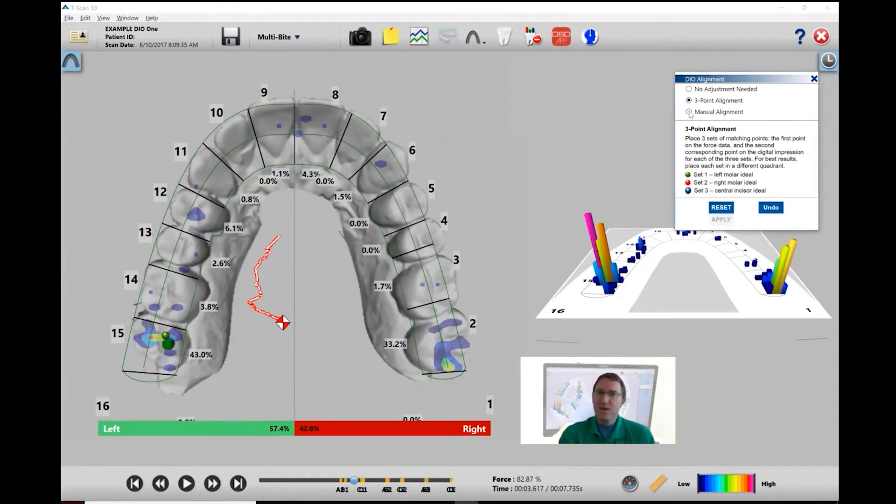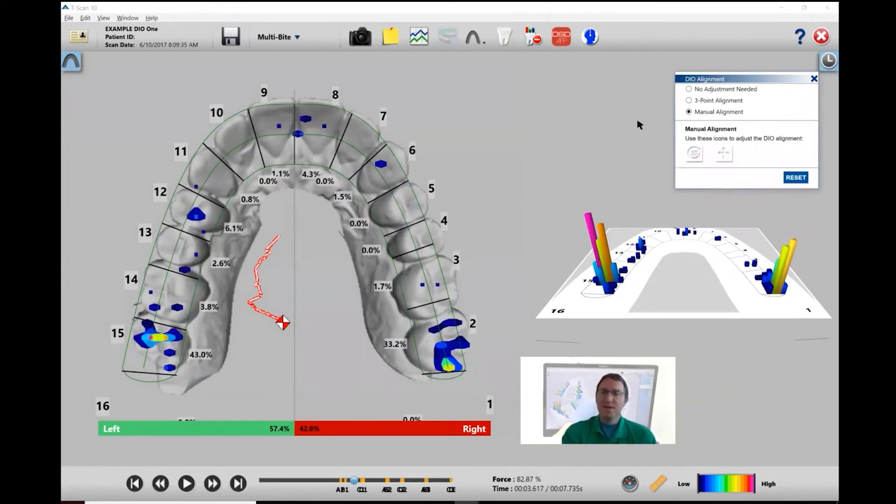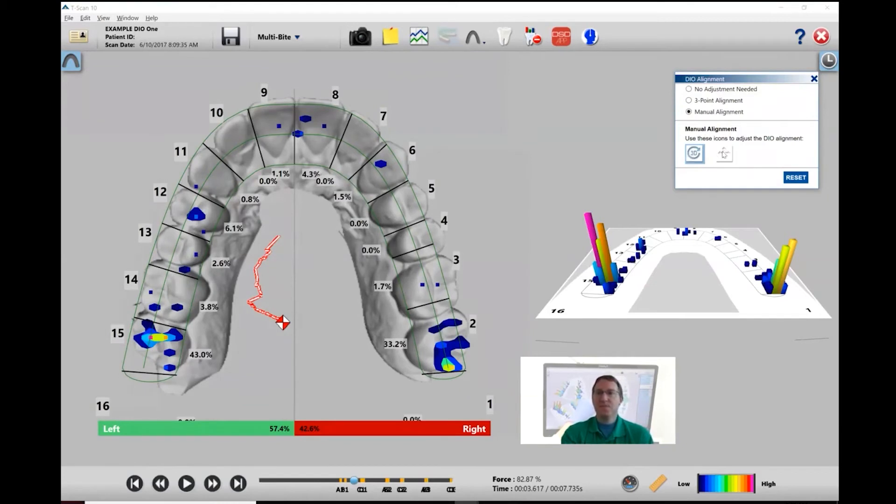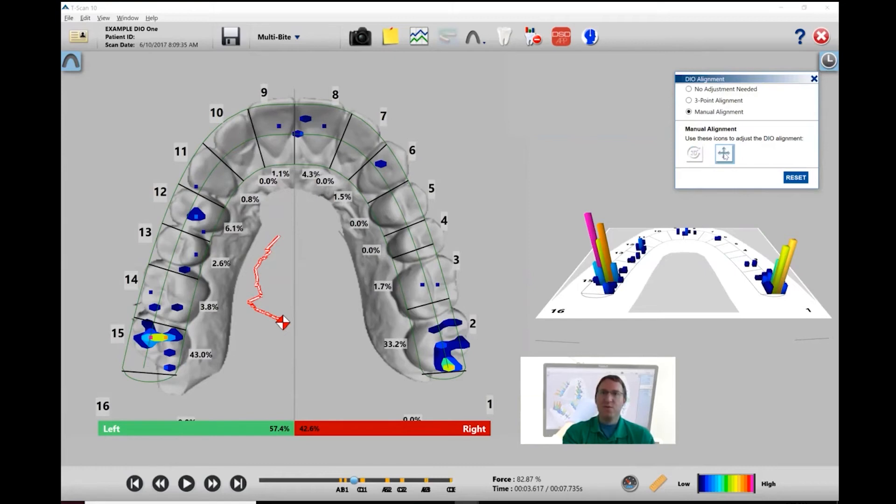The second way to do it, which is probably the most common way, is to use manual alignment. There are two buttons here. The 3D allows you to align the occlusal plane, and the second button allows you to align the vertical and horizontal positioning.